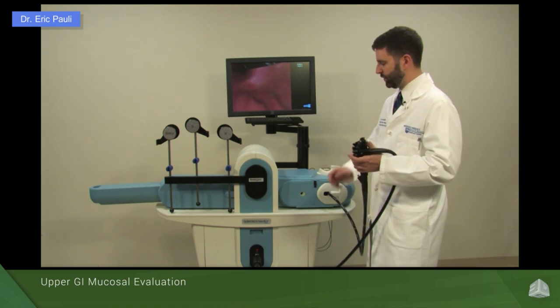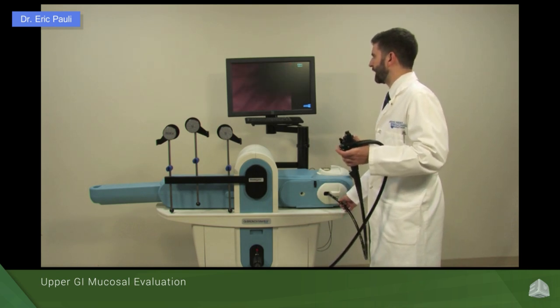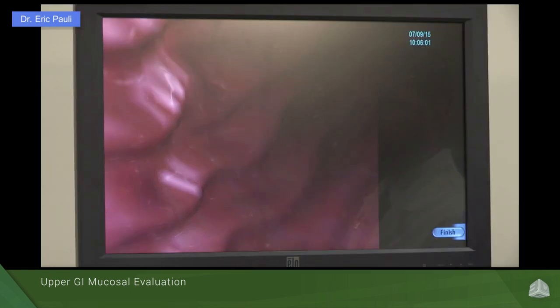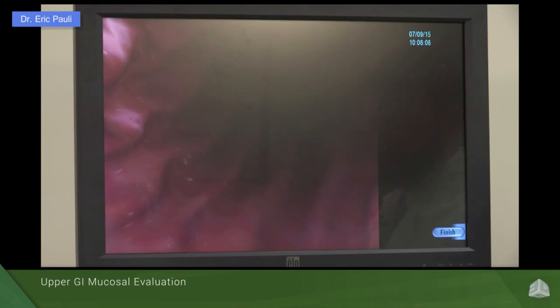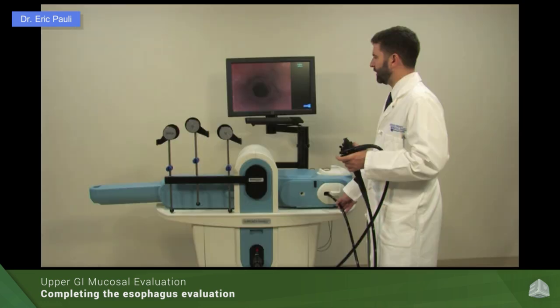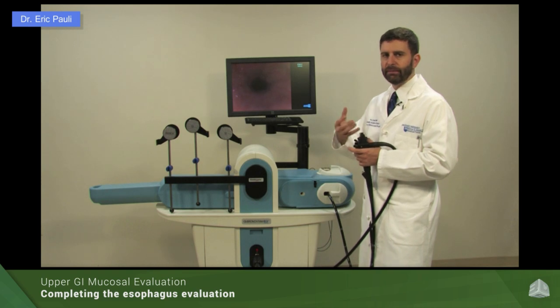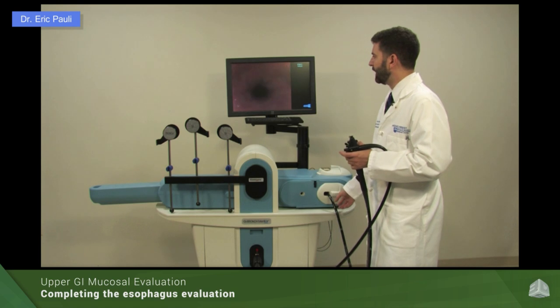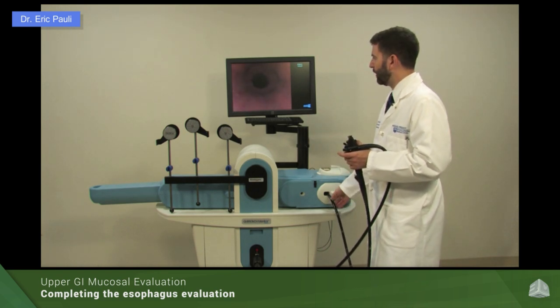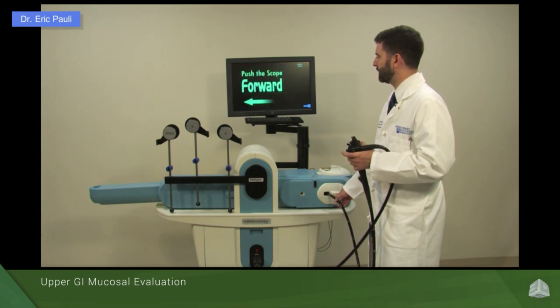To undo the retroflex, I'll put my wheels toward a neutral position and slowly withdraw the scope — that puts me back in an end-on view. Now I'm in a neutral position and can continue the rest of my inspection of the stomach in a prograde view, looking for pathology. Insufflate again to smooth out the rugal folds and better identify pathology. One area not thoroughly evaluated on the way in is right at the level of the cricopharyngeus — the patient may have been a bit uncomfortable and not fully sedated when the scope was advanced in. Toward the conclusion of the case, patients are generally more comfortable, so as you bring the scope back out at around the 18-to-20 centimeter mark, more thoroughly inspect the cricopharyngeus. Now we're back out at the hypopharynx and the scope procedure is done.